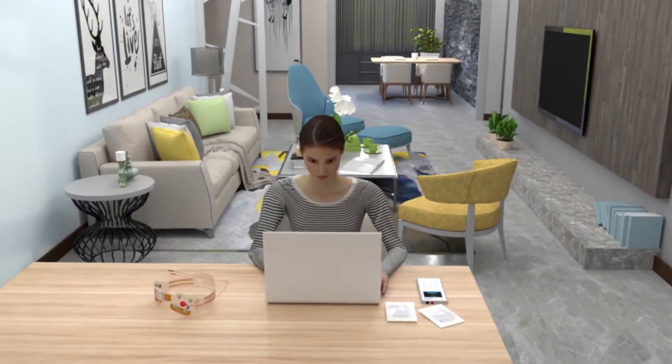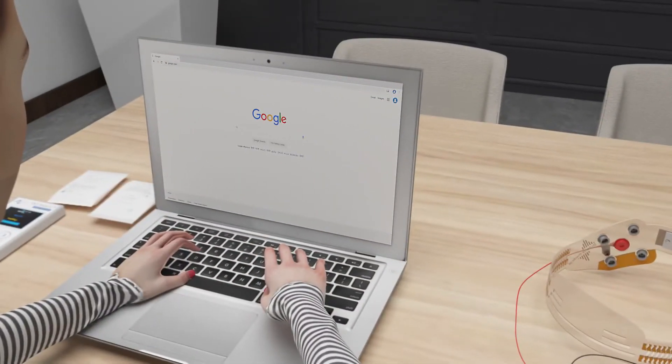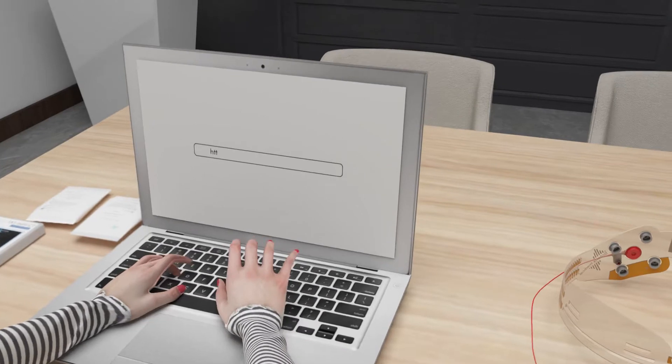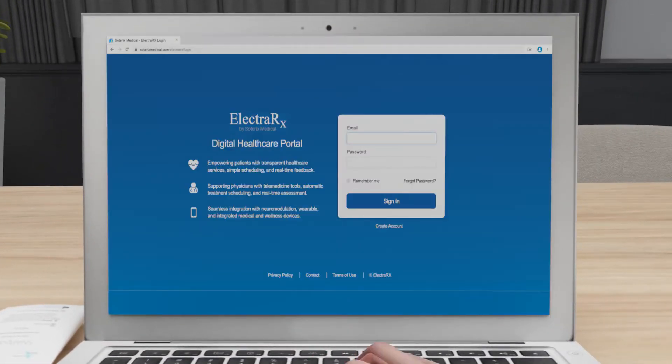This is a demonstration of how to use the Soterix Medical Remote Neuromodulation Equipment at home. First, log into the ElectraRx portal at SoterixMedical.com/ElectraRx using the login details that were provided by the doctor.